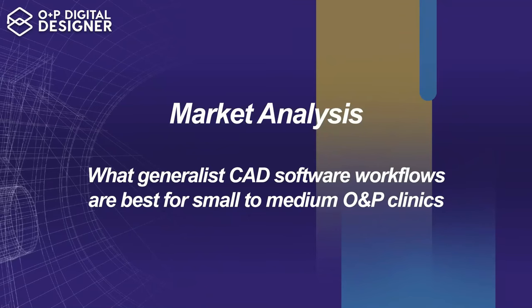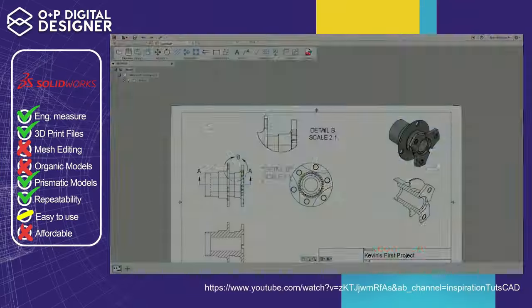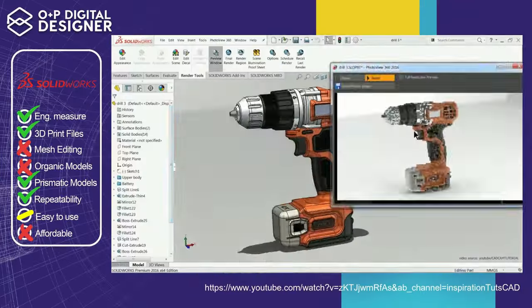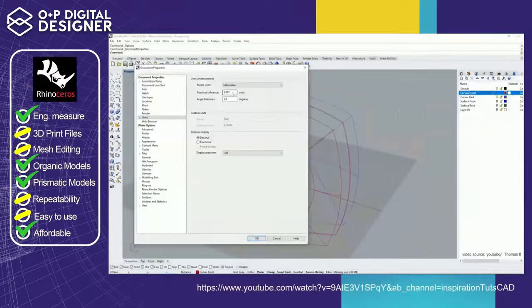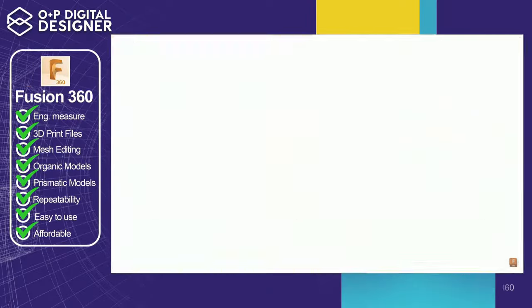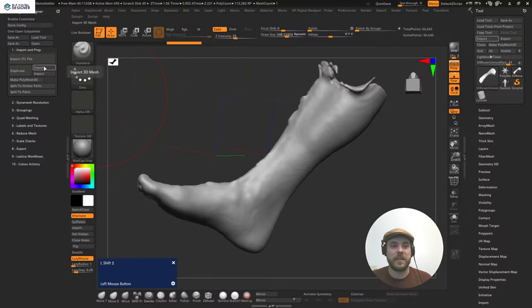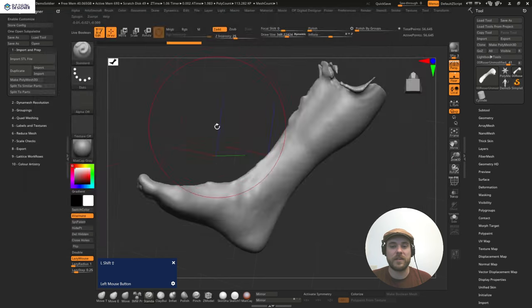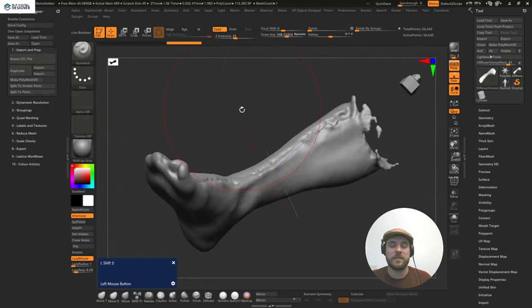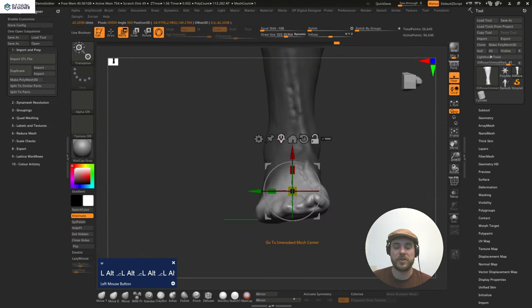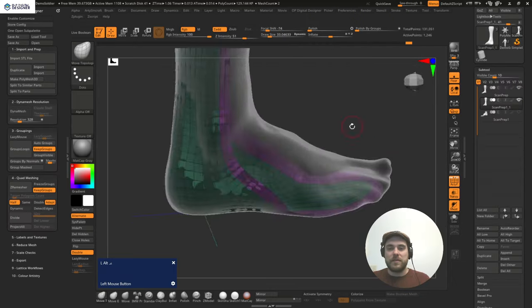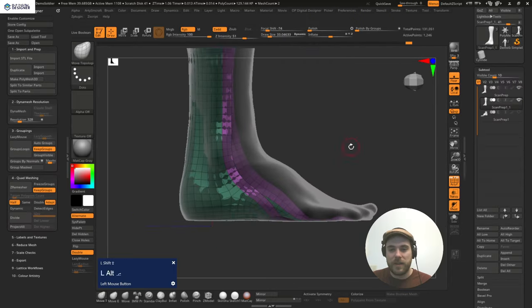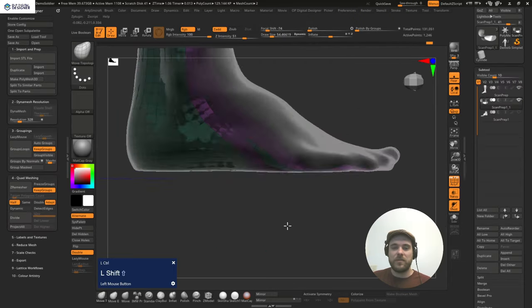This course will start with a market analysis of 3D design and how it impacts your business. We're going to talk about software comparisons and why these softwares were chosen as the O&P softwares of choice, and then we're going to take the deep dive and start off with a scan straight from an iPhone where we edit, align, clinically modify, and create trim lines from the scan in ZBrush for five major device types.